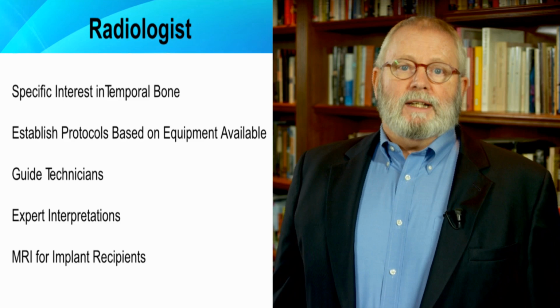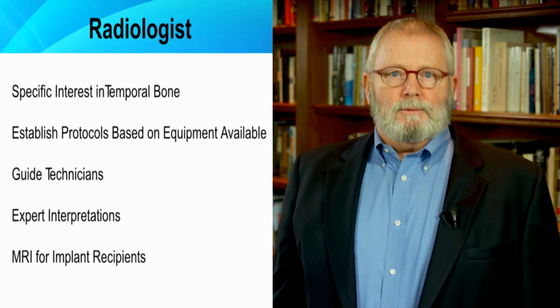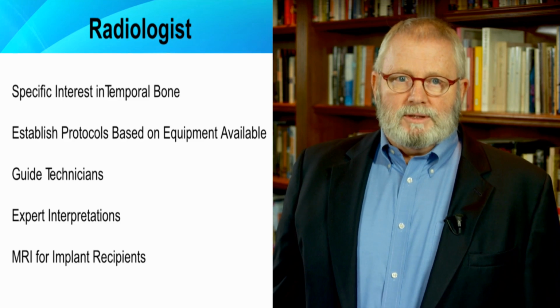Med-El devices are currently FDA approved for 1.5 Tesla MRI scans without magnet removal, but the other available devices are not. With careful binding of the stimulator receiver, some centers now perform MRI scans in implanted patients with the magnet in place, even for those devices for which it is not FDA approved.